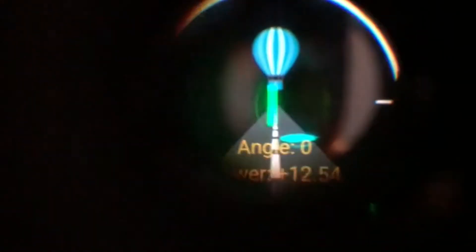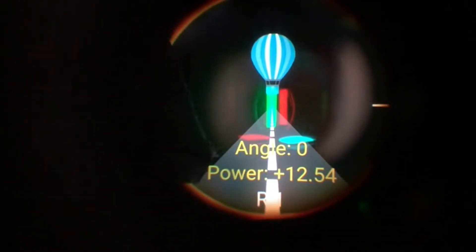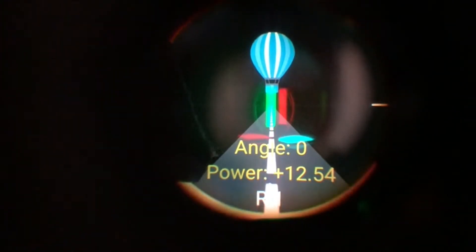Let's take a look at what's inside. The first thing you'll see is a very clear background — a hot air balloon and two very bright lines, red and green. On this prototype version, we want to demonstrate some useful information. The angle is the way the lines are aligned. Right now the lines are perfectly parallel. This is angle zero. The power is an estimation of refraction. As I press the buttons on the device itself, the lines will begin to move.